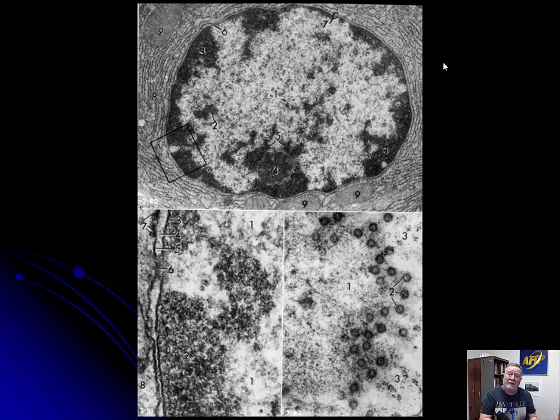If you're not looking at that, then maybe you're looking at a part of a cell, like a platelet, or as we get into cellular degeneration, maybe you're looking at a fragment of a cell, but they all have a nucleus. Now, I've seen people describe, and this is a very important concept, nucleus as a very large nucleus or a very small nucleus. Now remember, when we take sections for EM, they're incredibly thin. They're much thinner than our typical 5-micron segment for a microscope. And so you can get many sections and views through the same cell.